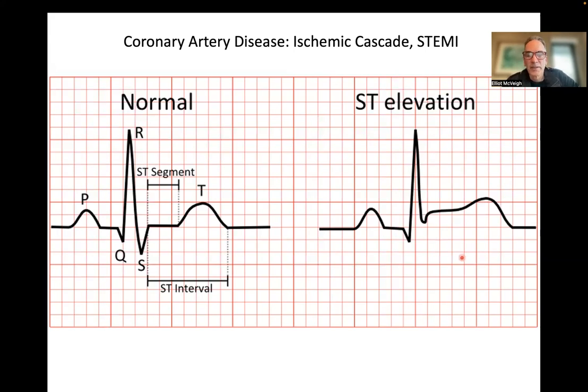And there's plenty of false positives. They'll go in, they'll see this, and they'll look at all the vessels and say, well, there's nothing severe enough in here that I'm going to treat. And so now you've kind of caused a problem in that you've wasted a lot of resources on doing a diagnostic study that's quite expensive, and it's going to result in no treatment. So that's where imaging can come in.